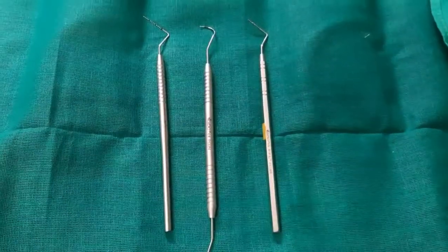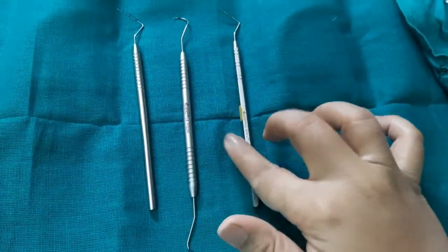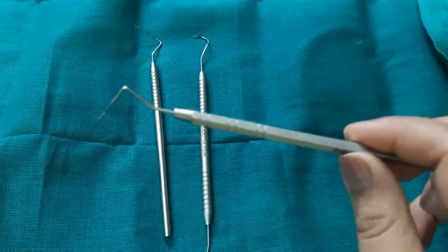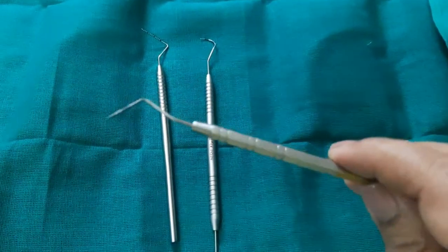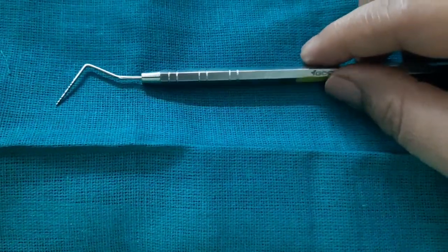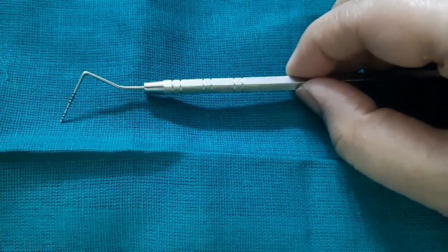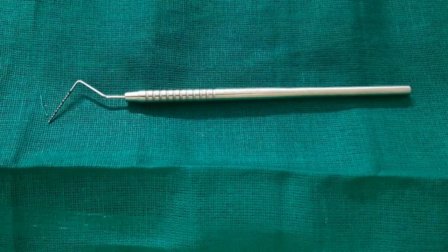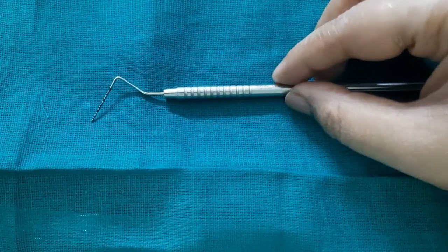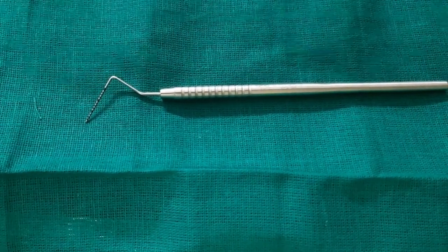Now let's come to the periodontal probes. Periodontal probes are of many types but here we will show the three most commonly used. The first is the Williams probe — different probes have different markings. The Williams probe has ten markings where the markings are absent in the region of four and six millimeters. The next one is the UNC 15 probe, which has markings from 1 to 15 with color coding at every five millimeters — that is at 5, 10, and 15 millimeters.